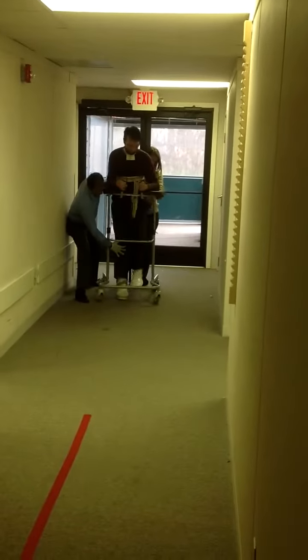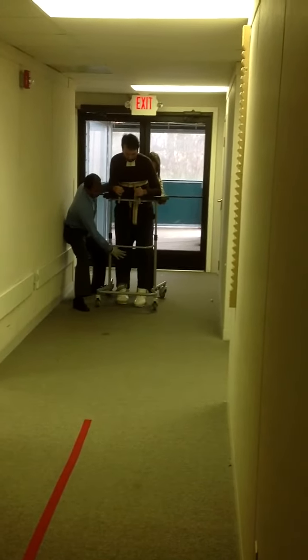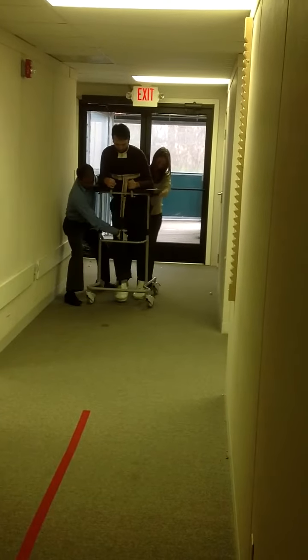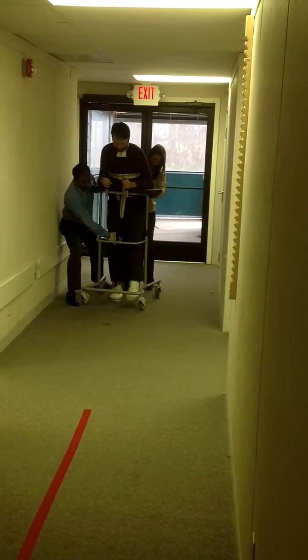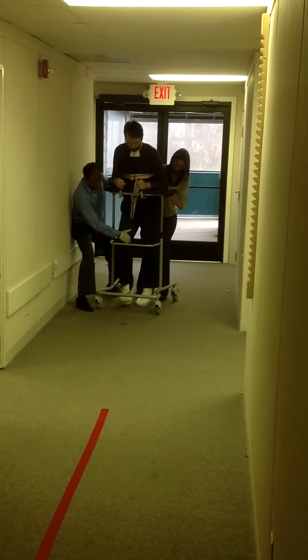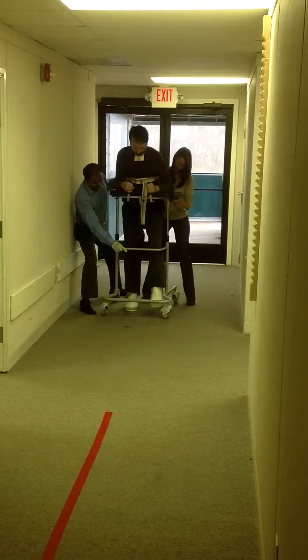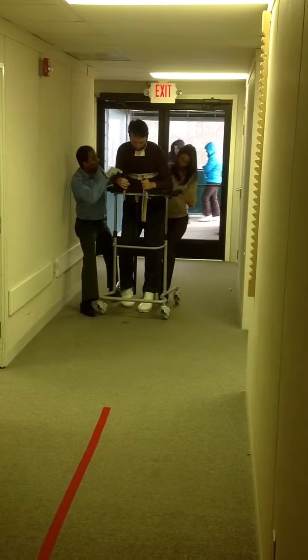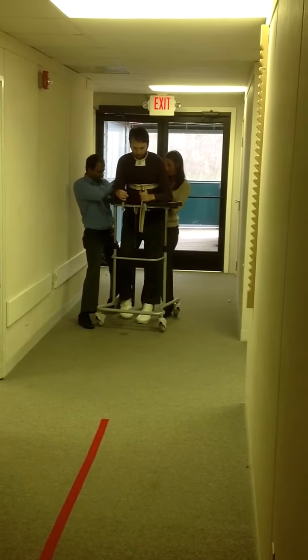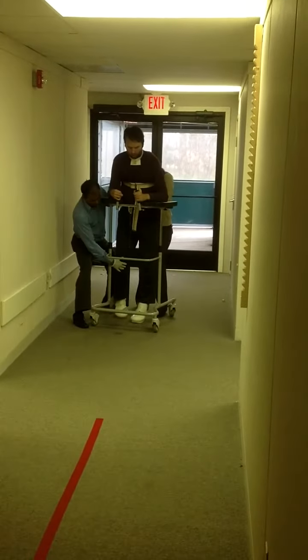Grab. Small steps. Walker. Grab. Small steps. You're going to control the walker too, okay? Make sure you keep your walker straight every time. Ready? Okay, let's go.